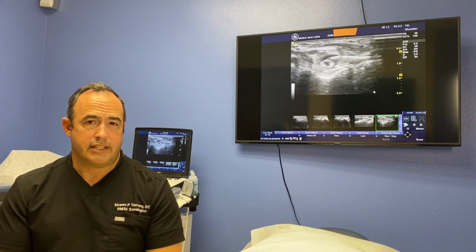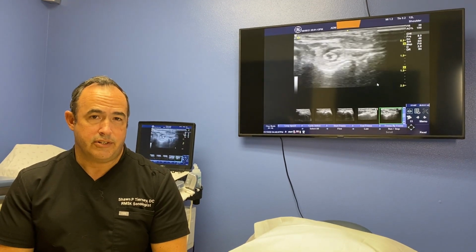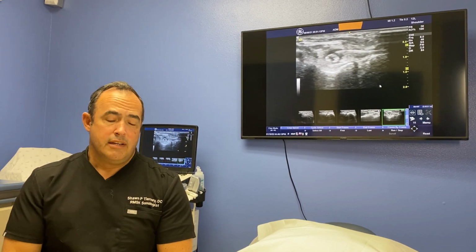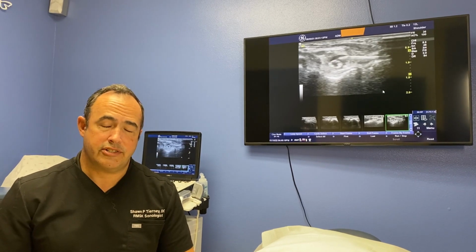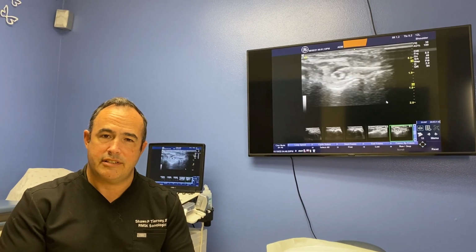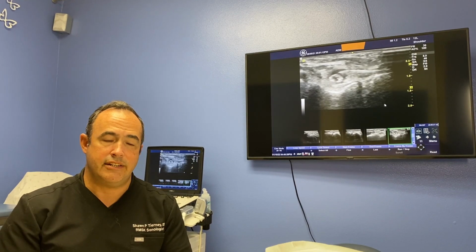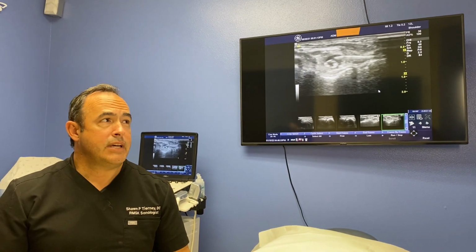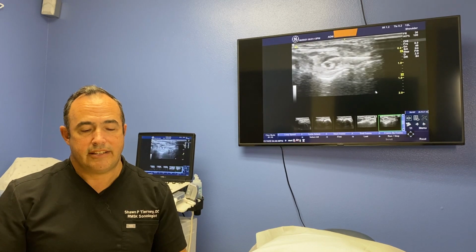Things that we do here regularly at Pacific Healing and Wellness, I work with Dr. Sandra Goins to assist in the procedures using diagnostic ultrasound. So what we do is we are able to look at a structure and put a needle right next to that structure. Now that's been a game changer when we started thinking about nerves, because with musculoskeletal ultrasound we can see nerves more clearly than we can with other imaging modalities. So we have the ability to see nerves, we have the ability to see something going directly at the nerve.